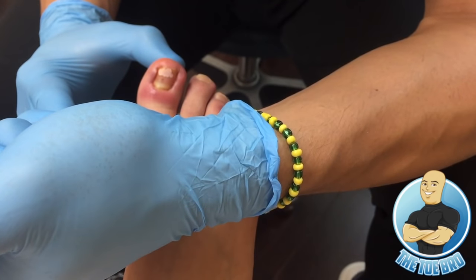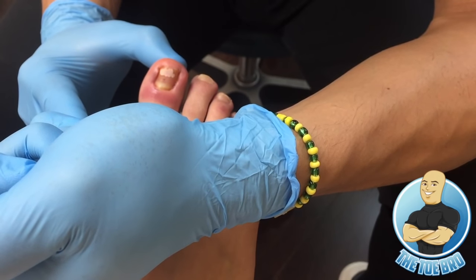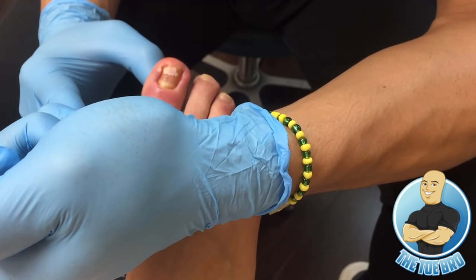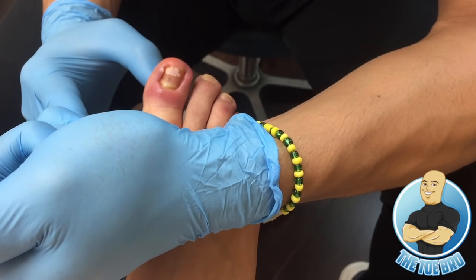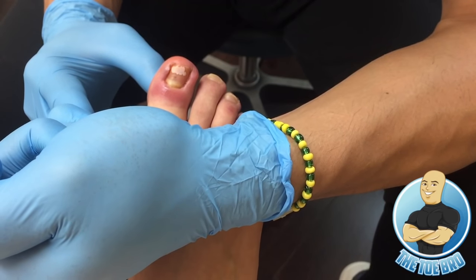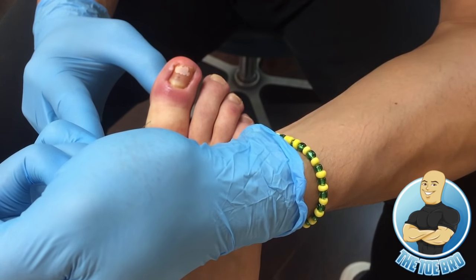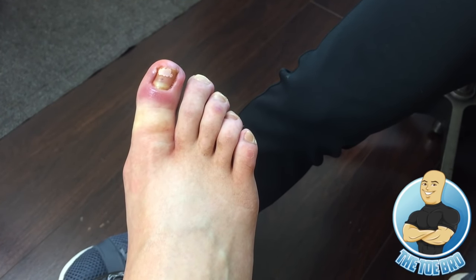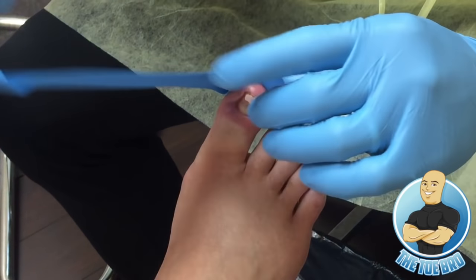On three. Here we go. One, two, three. It did, but I don't want to tell you. But you're okay. Any pain over here? No. See, when you do this every day, you get pretty good at making it easy. Was that bad at all? No. Just pressure, right? You feel a lot of pressure? Toe. One side done. Wow, it got like really swollen. So that's all the fluid that we injected into the toe. That's what I was about to say.